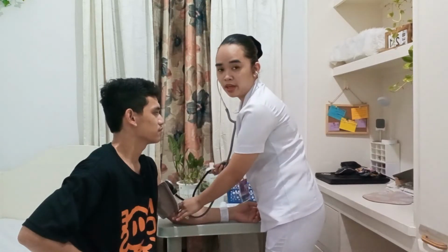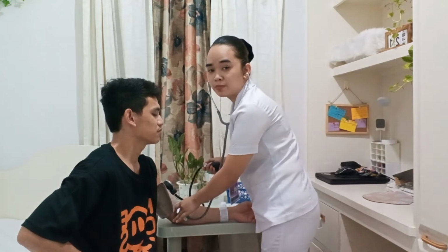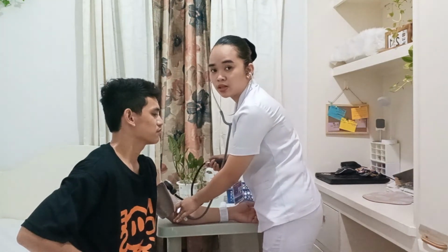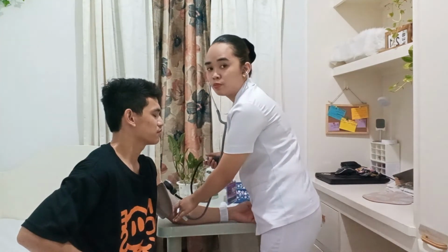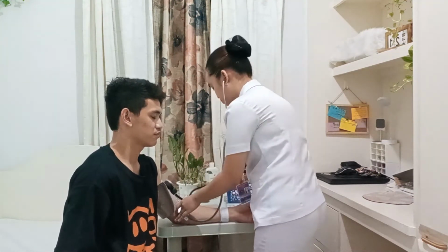Now I'm going to inflate the cuff until the sphygmomanometer reads 30 millimeters of mercury above the point where the brachial pulse disappeared. So I'm going to inflate the cuff to 140 millimeters of mercury.